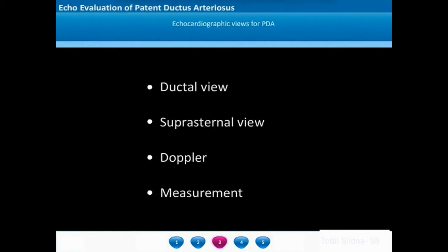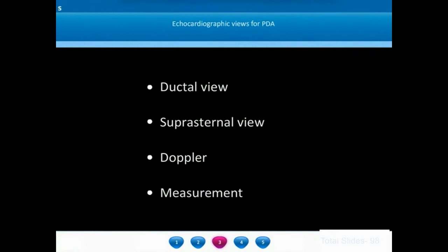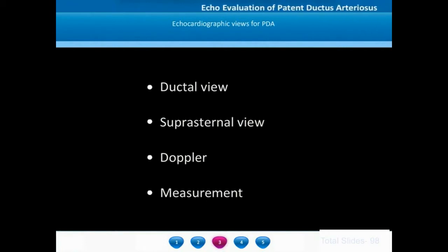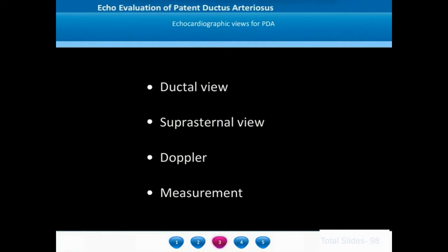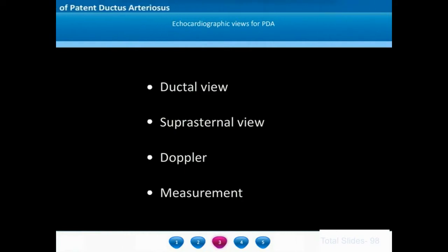The echocardiographic views of the PDA are primarily through the high left parasternal view, called the ductal view, and the suprasternal view. We will show how to assess Doppler flows across the ductus and how to measure the ductus for the purpose of intervention.